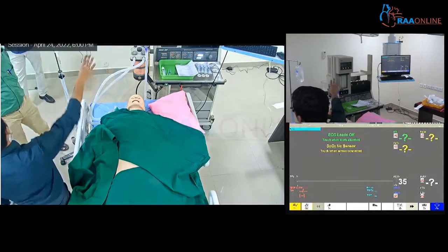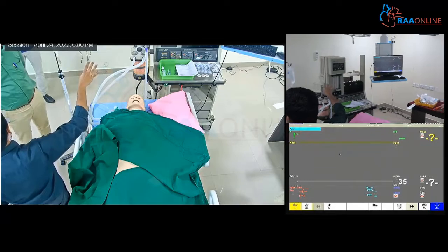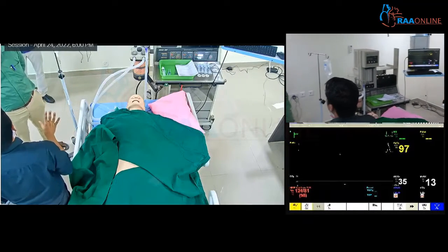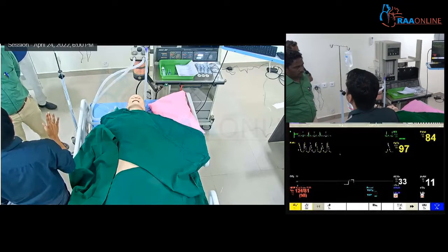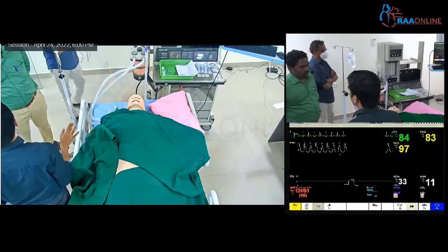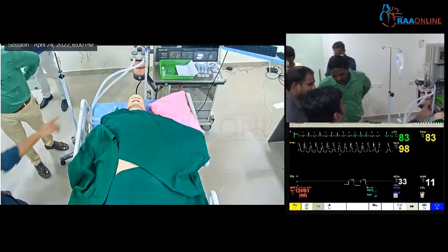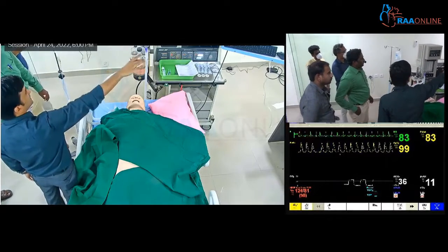So this is an old workstation. We don't have an oxygen supply as such. We are going to run it through cylinders. The idea here is to learn about mask ventilation and intubation, and decision making for the same if there is going to be any difficulty in either of these. When you ask for a monitor, you will get all the displays, the ECG and monitor.